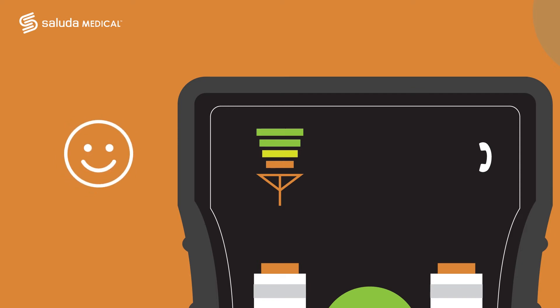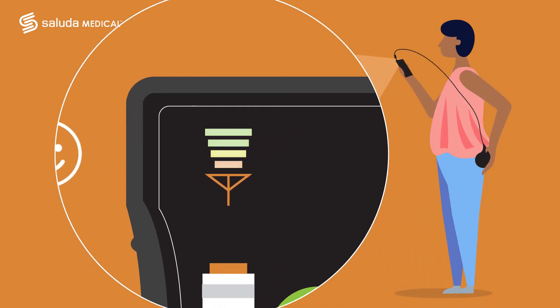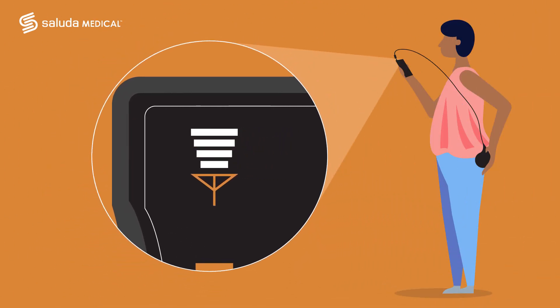To improve the quality of the link between the charger coil and the EVOKE closed-loop IPG, move the coil closer to the implant.